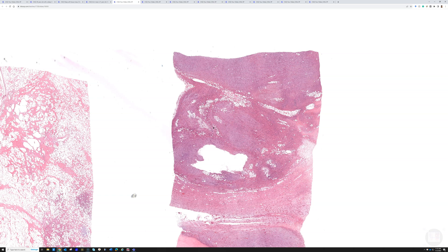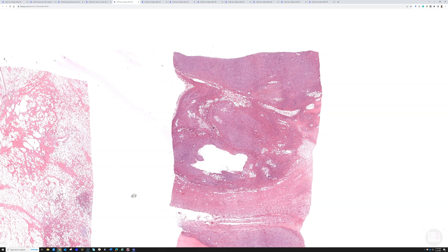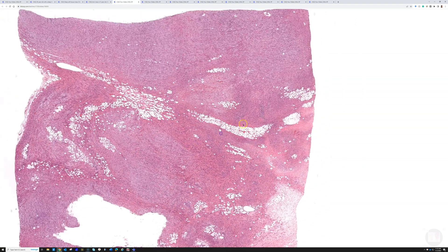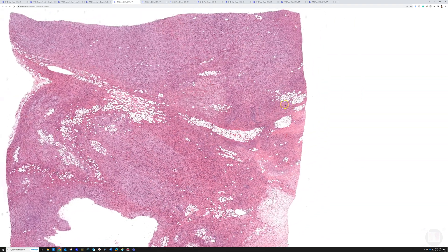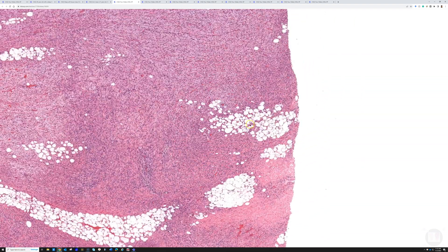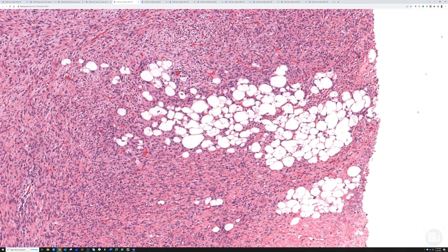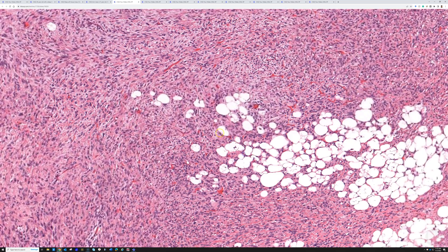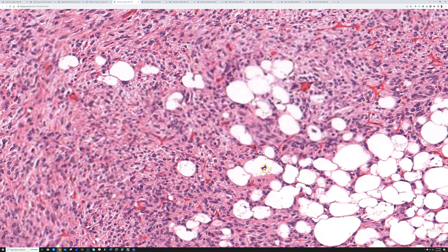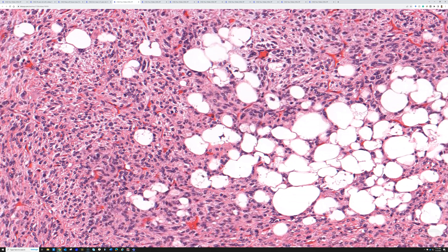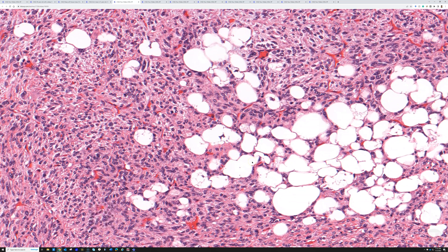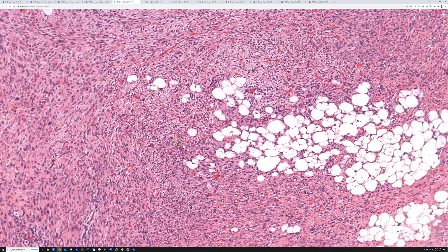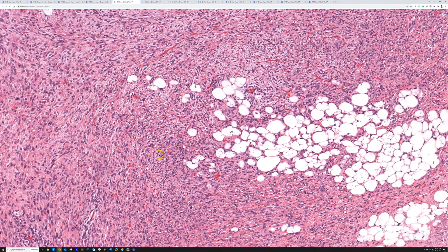The de-differentiated component can have a wide range of different morphologic features. A lot of them look like undifferentiated pleomorphic sarcoma - bizarre, atypical spindle cells with no fat, no lipoblasts, nothing. But a subset can actually have lipoblasts. Now we recognize that a small subset of de-differentiated liposarcomas actually do have pleomorphic lipoblasts, called homologous lipogenic differentiation.